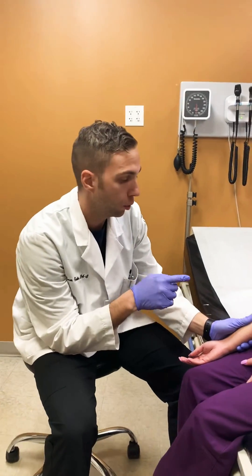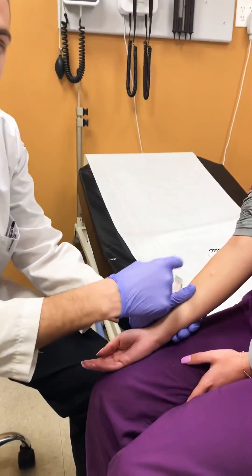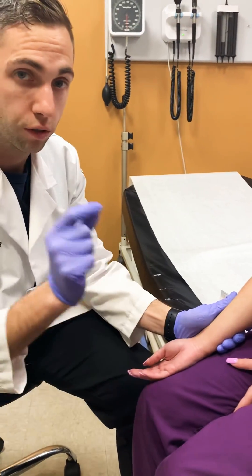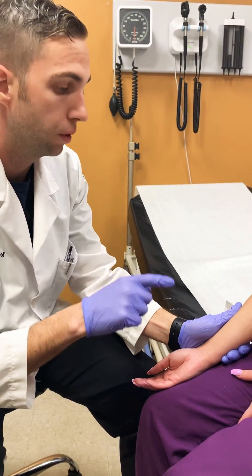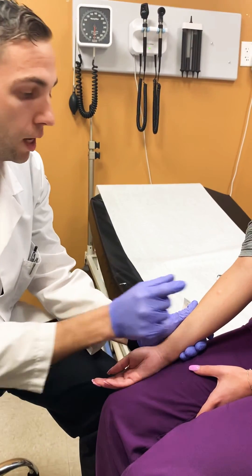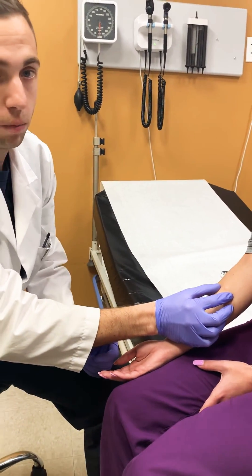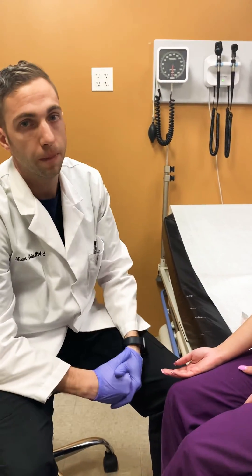When you read a PPD, it's important that you're not reading how red it is or the erythema around the site, but it's actually the induration, which is the firmness under the skin — that's very important. The way you measure that is the same way: you feel it between your fingers and take your ruler to make the appropriate measurement. That's how you do a PPD.